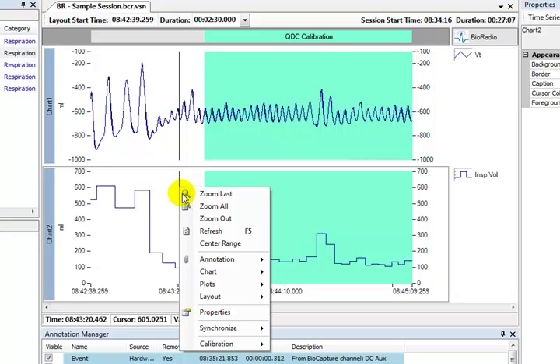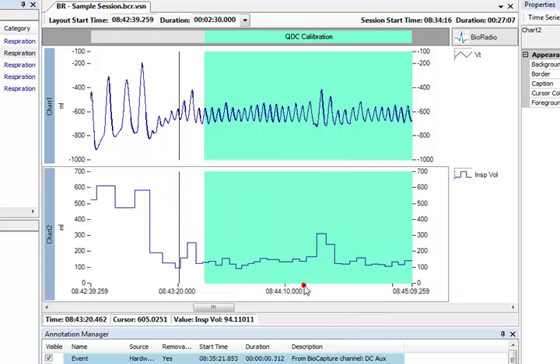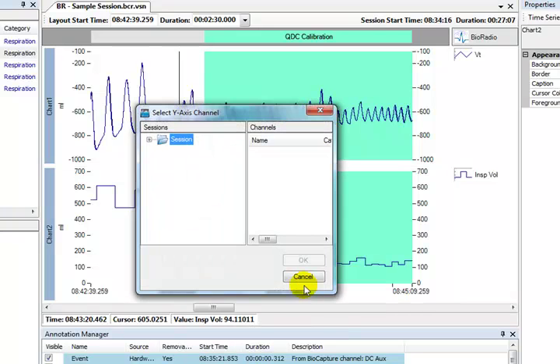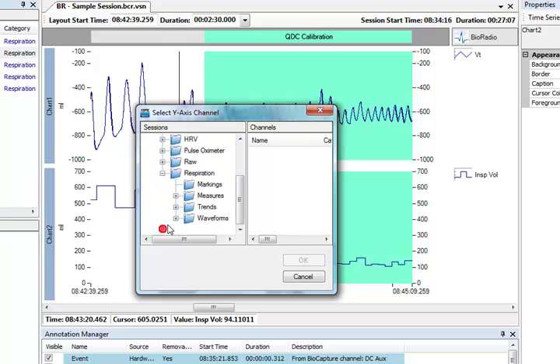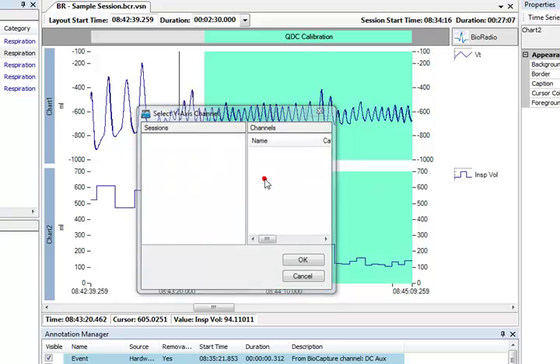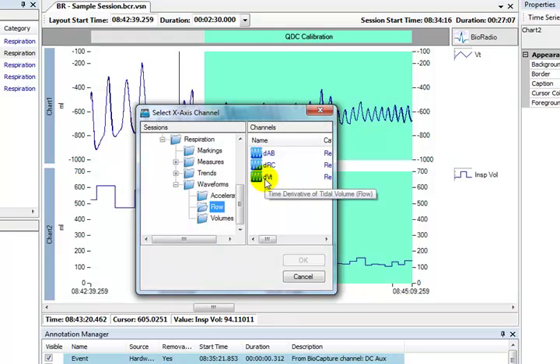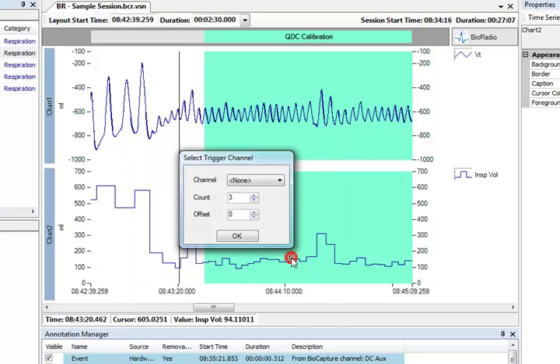To create a phase plot in VivoSense, right click anywhere on the synchronized chart panel, choose chart, and then new phase chart. We see a dialog with all our data channels and are asked to select the Y axis channel. For our flow volume loop we will select the DVT or tidal flow channel and press OK. We now select the X axis channel to be our tidal volume VT. Finally, we are asked to select a trigger channel.